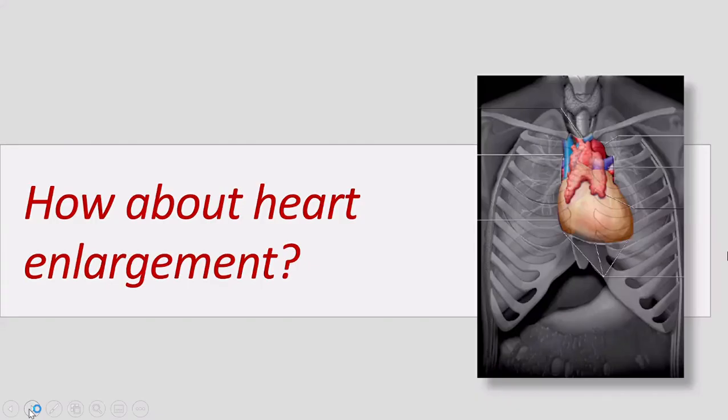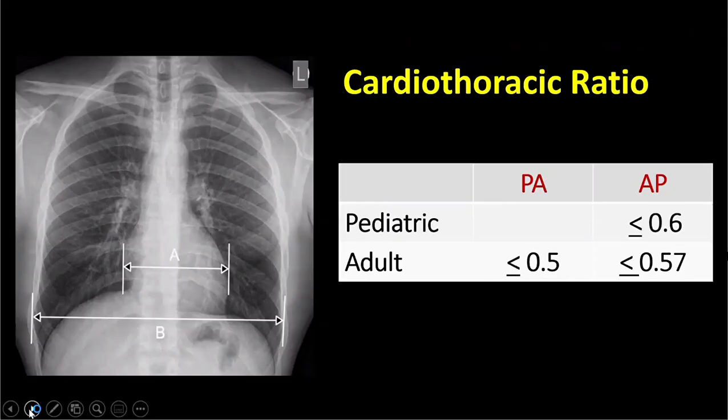So now let's talk about heart enlargement. Through X-ray, is it possible to determine which chamber of the heart is enlarged? The answer is yes.